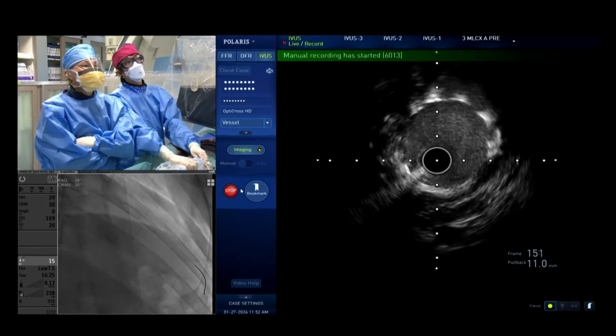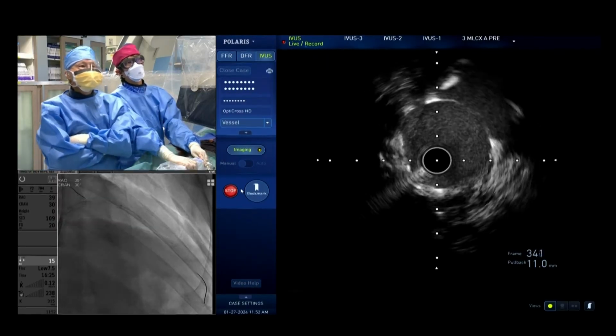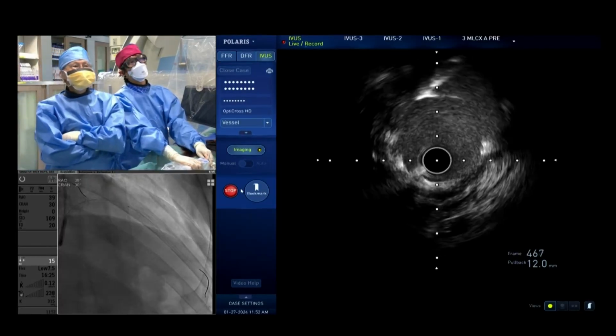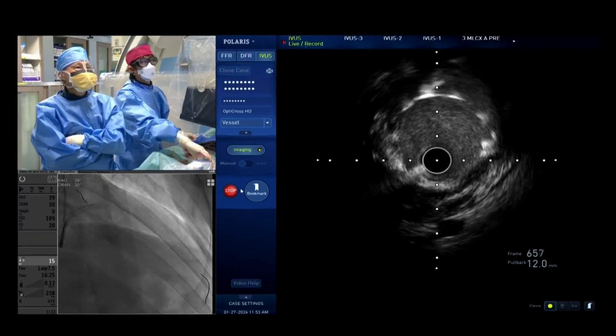The sub wire is coming in from the top there. You can see at 12 to 2 o'clock. At least for this off-angle view, the lumen looks pretty decent. It looks quite good. What do you guys think? I think it can be left alone. Yeah, good to me. The folks here think that it can be left alone.